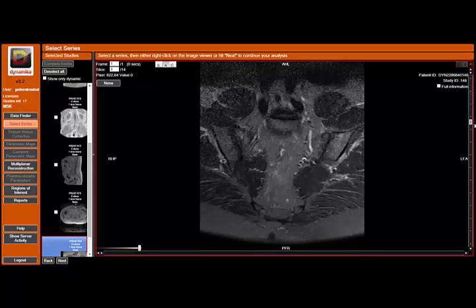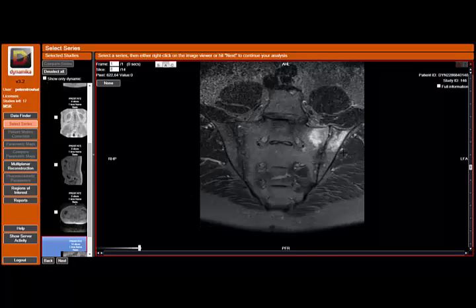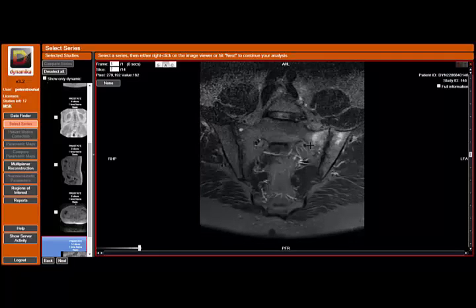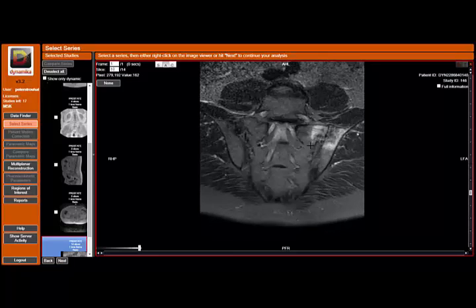derived from a method initially employed for isotope bone scans to work out the presence of sacroiliitis or to exclude it. And although based on a rather crude test, we are refining it for use with MRI.